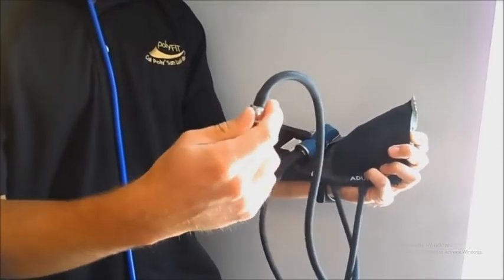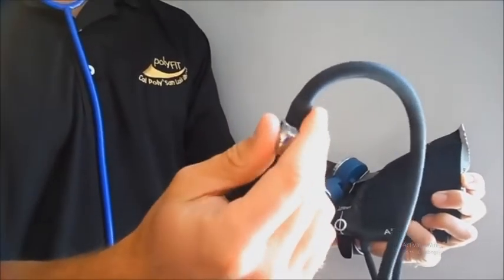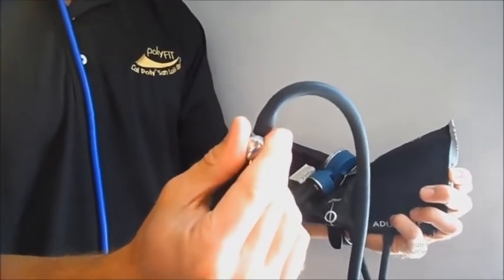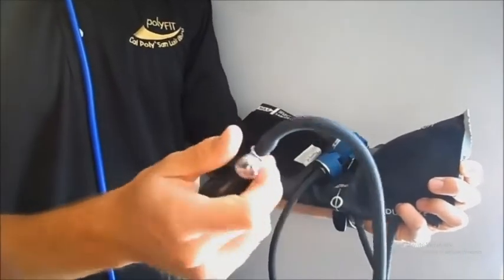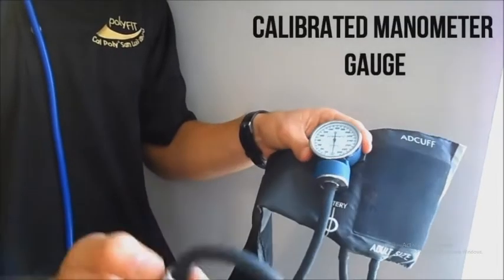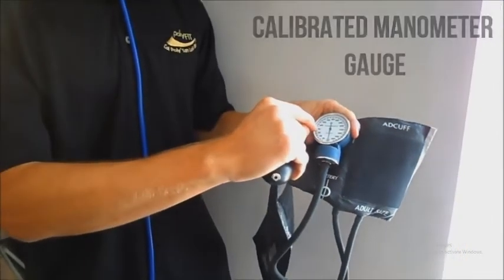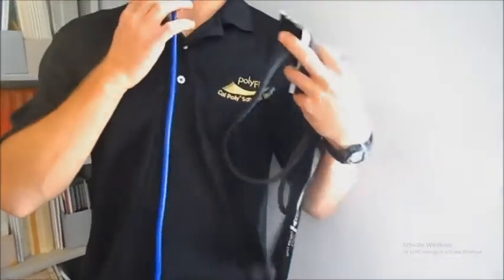Before you begin, you have to make sure this is twisted all the way to the right, righty-tighty, lefty-loosey. When you have it all the way to the right, that's how you close it off so that air actually pumps into here. Otherwise, you'll keep squeezing and nothing will be happening. The meter, when you pump it up, lets you gauge how much air you have in by how high the numbers are. And you listen for the pulses with the stethoscope.